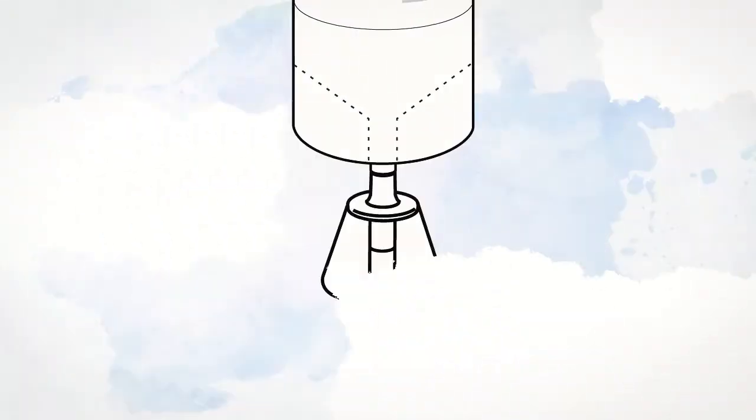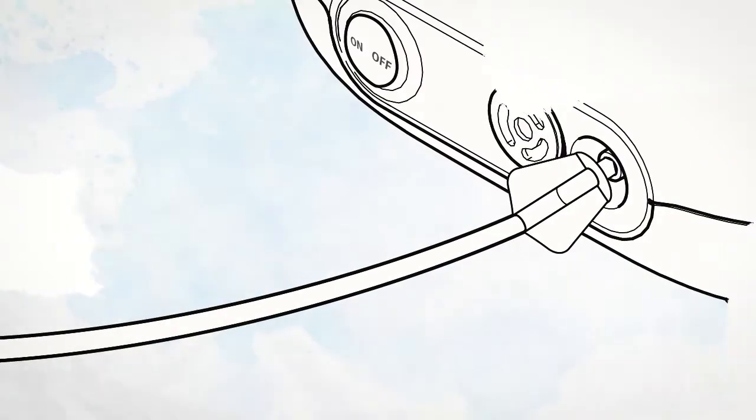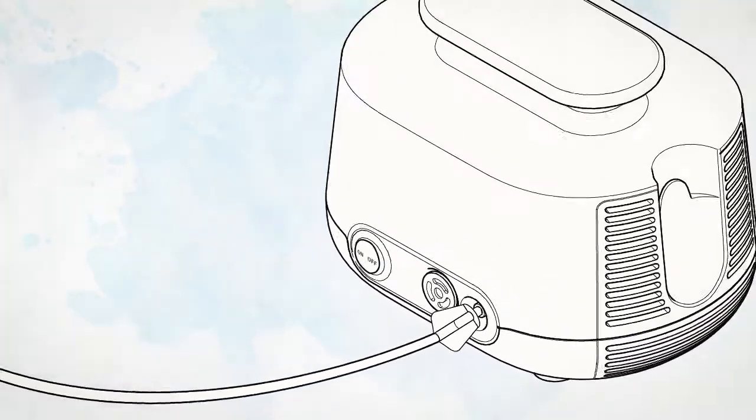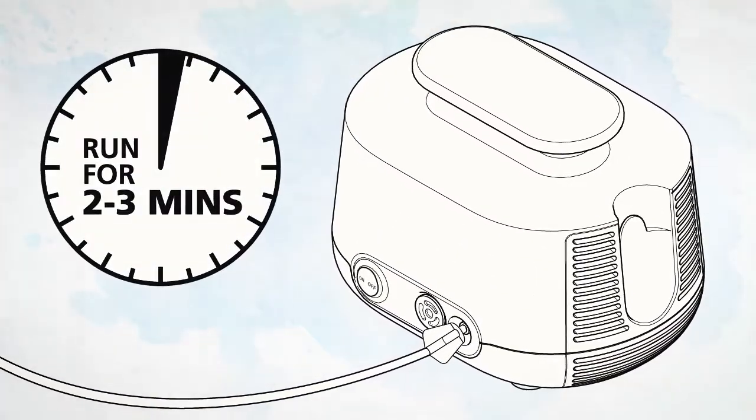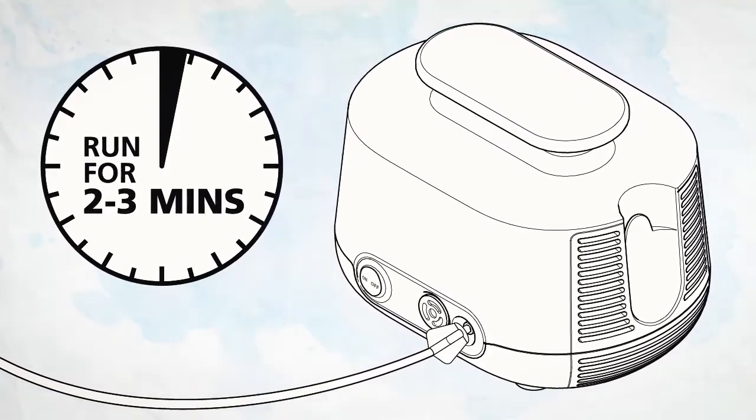To start, disconnect the tubing from the air intake on the bottom of the nebulizer cup. If there is any moisture or condensation in the tubing, let the compressor run with only the tubing attached for 2-3 minutes. The warm air from the compressor will dry out the tubing.